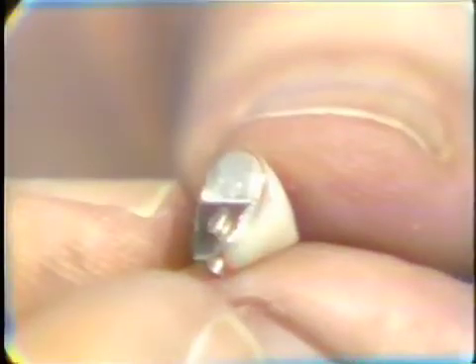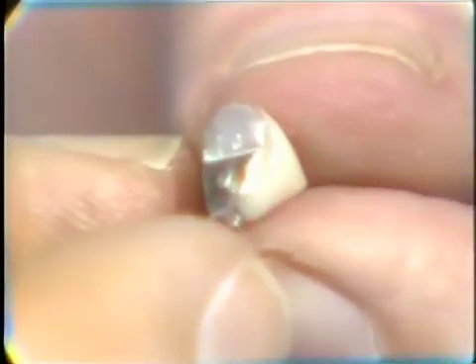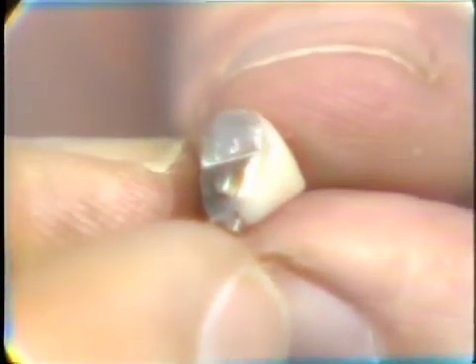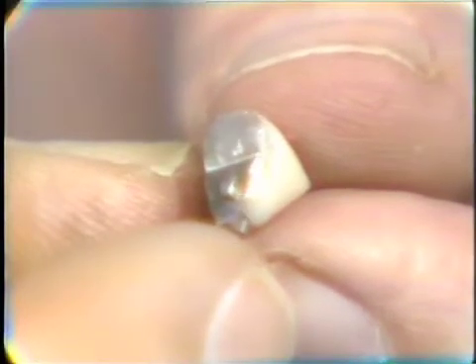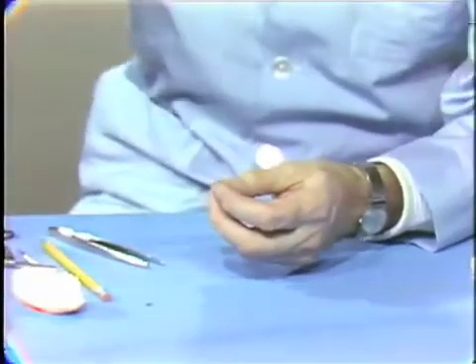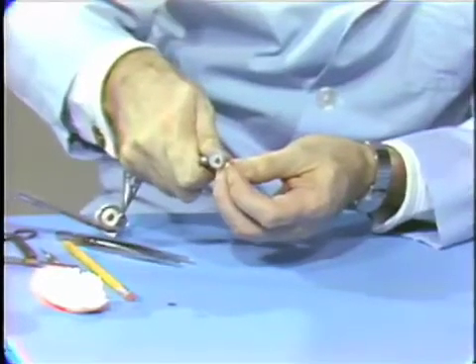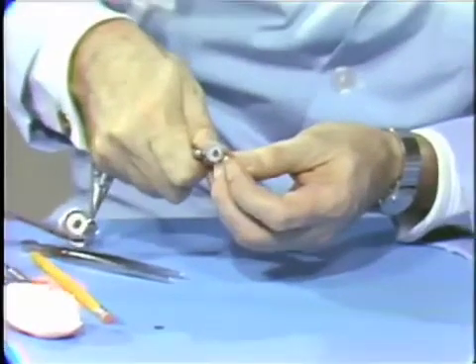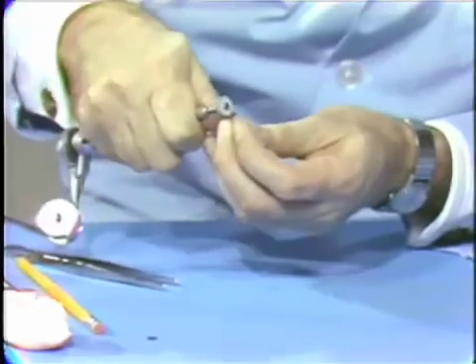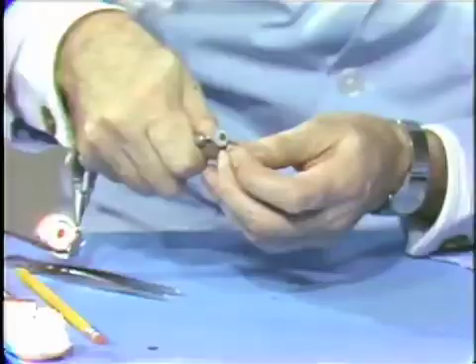The backing has been slipped onto the porcelain facing here, and I think you can see that we've got a reasonable adaptation, with the exception of that one area perhaps where the keyway there is still projecting out, and that has to be adjusted. A fairly easy way of doing that is with a heatless stone, and if this is done carefully, you can do it with the backing in position on the porcelain, so that you've got a good guide at the point at which to stop. So with a heatless stone, gently trim back that keyway area that is projecting out there.